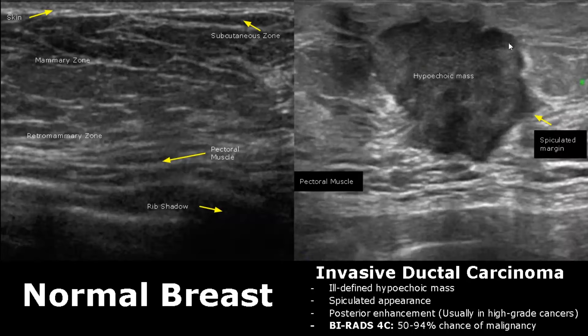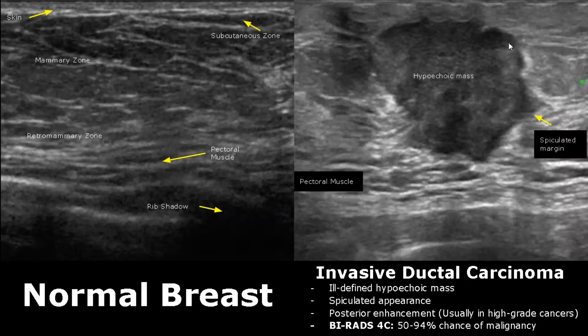Here we have invasive ductal carcinoma with posterior acoustic enhancement. This enhancement is usually a sign of a higher-grade cancer. It also has a spiculated appearance suggesting a malignant lesion. It is rated as BI-RADS 4C.